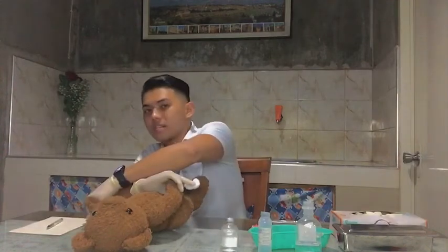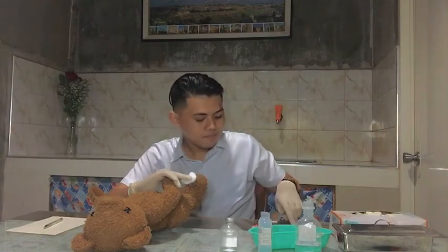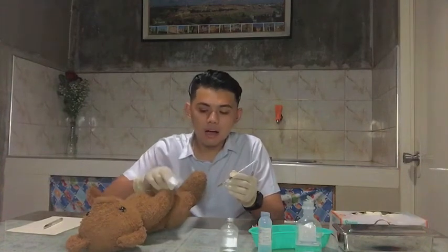So, prepare the syringe for injection, remove the needle cover and discard without contaminating the needle. This helps to avoid contamination. And drying the skin prevents inactivation of the drug being given. Now, inject the medication using the Z-track technique. Use the ulnar side of the non-dominant hand.